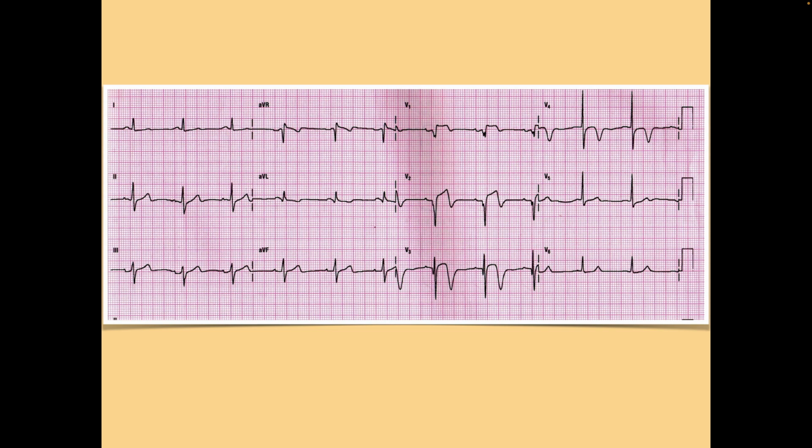Now, just to let you know, we are definitely going to make a distinction between septal and anterior. There are some references that don't. They just call V1 through V4 the anterior leads, okay? But we're just going to go with V1, V2 septal, V3, V4 anterior. But think of it as just one big contiguous strip across the front there.